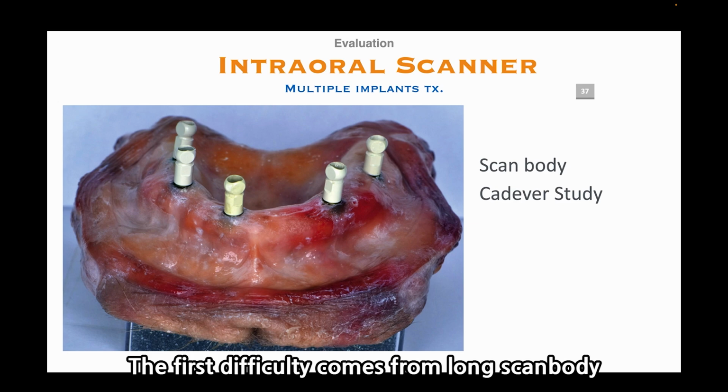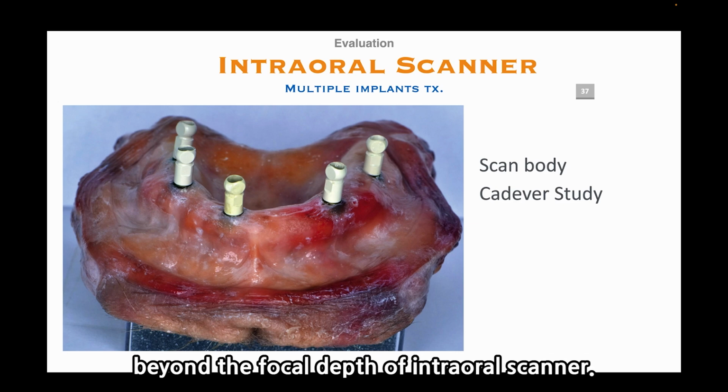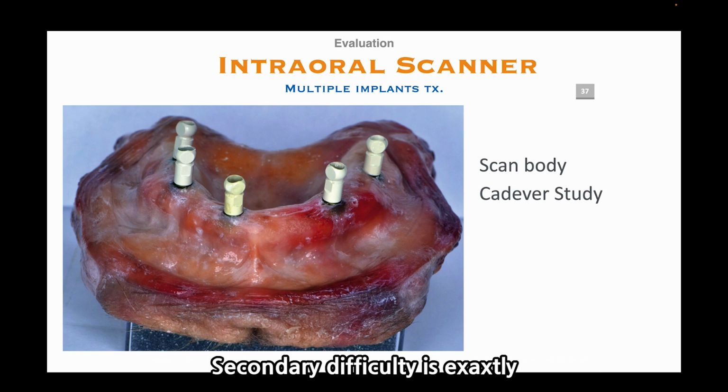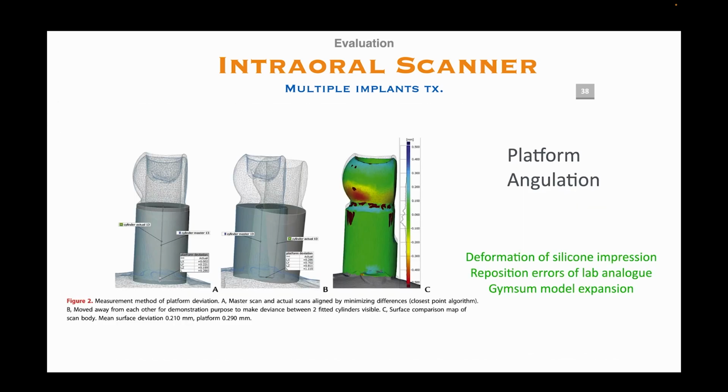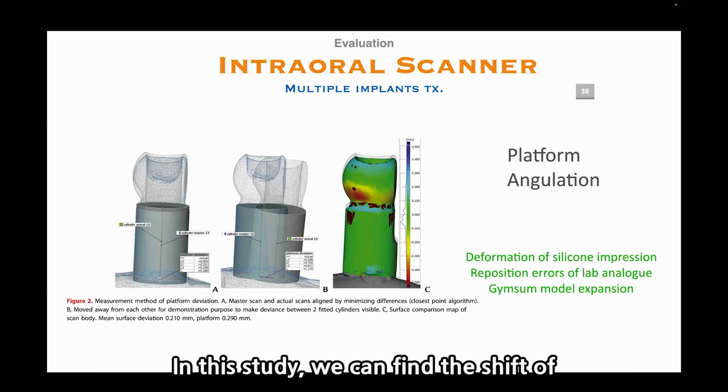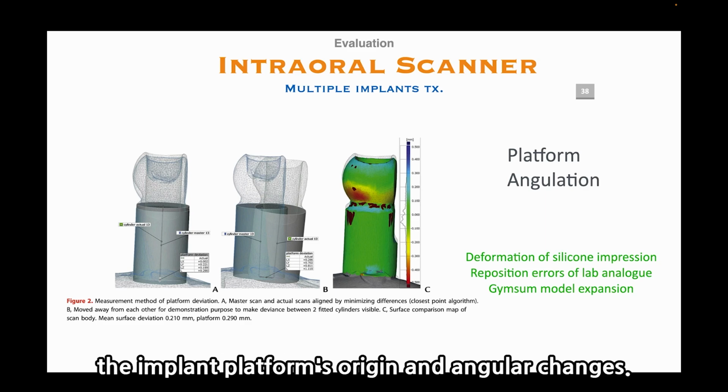The first difficulty comes from a long scan body beyond the focal depth of the intraoral scanner. The second difficulty is exactly the same scan body geometry plus smooth surface. In this study, we can find the shape of the implant platform's origin and angular changes.